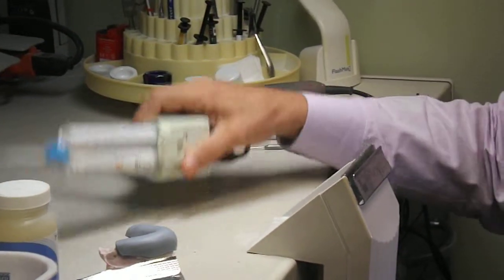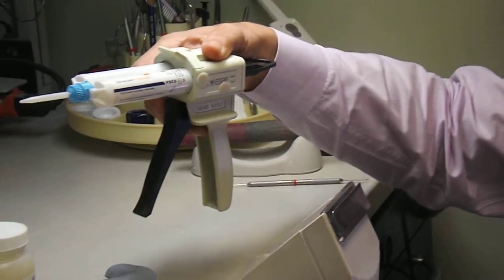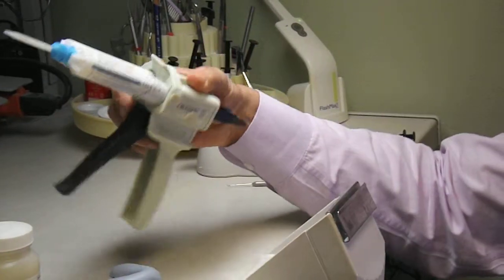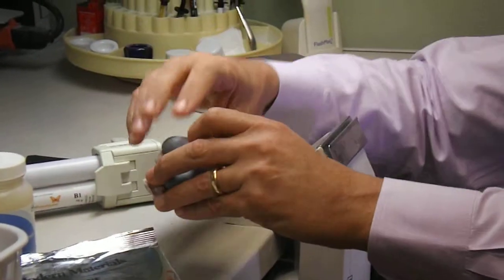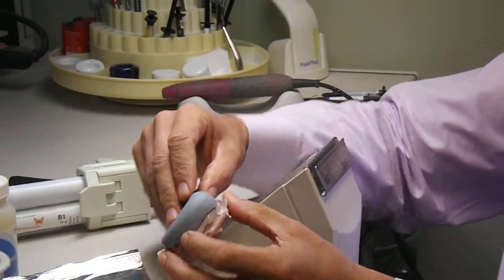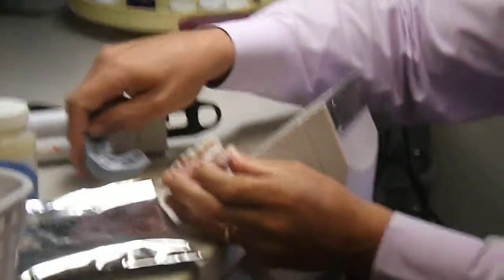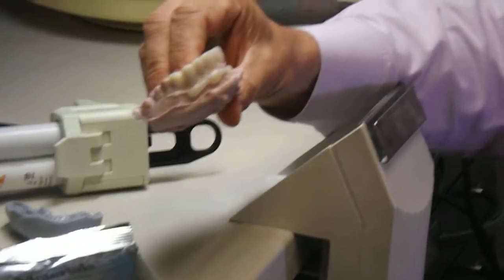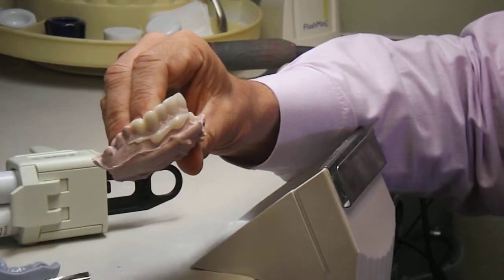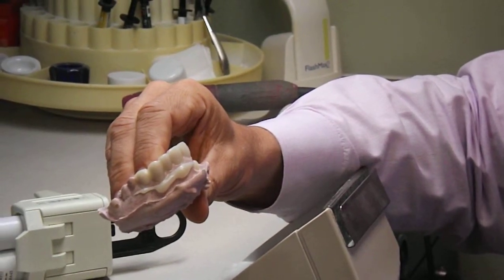In this case, I'm using Structure Premium Bisacryl provisional material by Voco, and I've placed that in the Siltec mold that I made from the diagnostic workup. Now we've seated it on the model, and I'm just lifting the Siltec off. This is the provisional that I have to start with, and I've got some time to do that while my assistant is placing retraction cords.